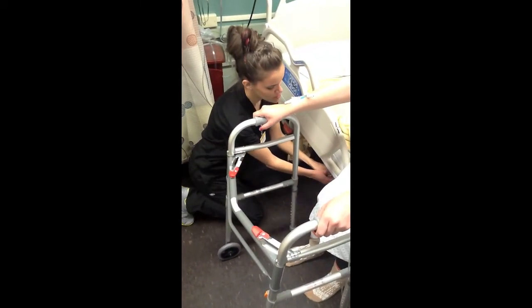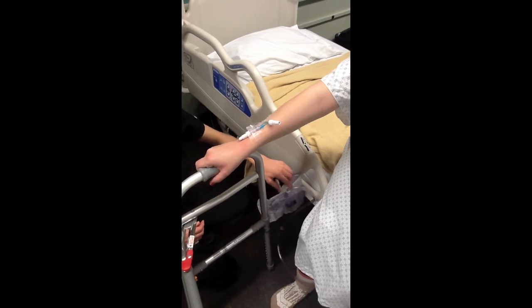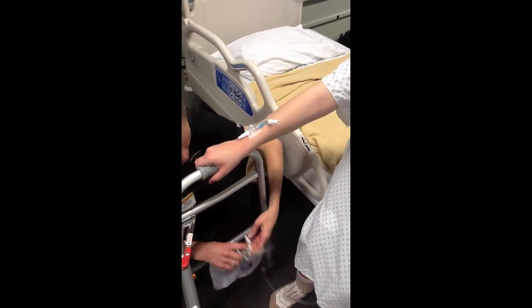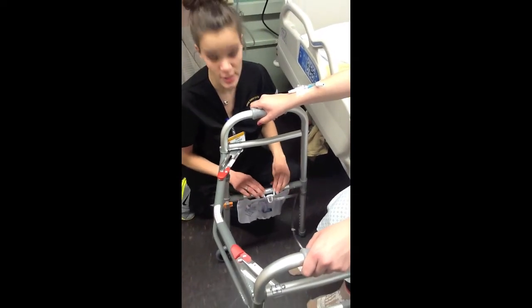When ambulating with the patient, the Foley bag must remain below the waist of the patient to reduce the risk for infection. If the patient is using a walker, you could hook the Foley bag on the side of the walker, which would reduce the number of tethers that you have to carry.